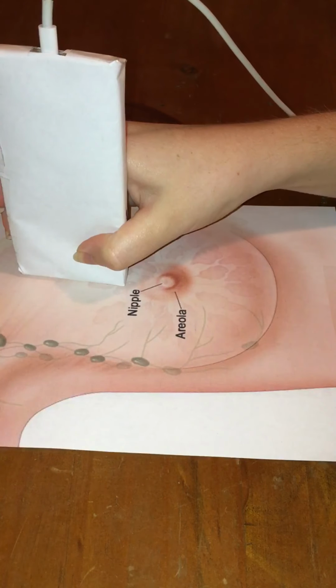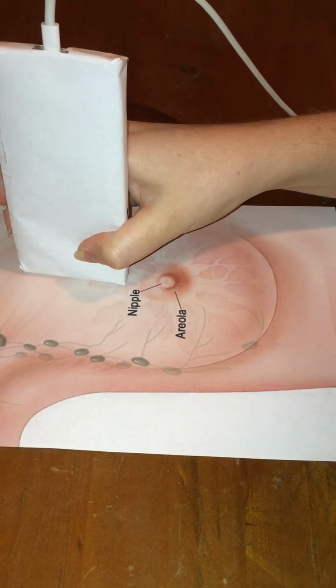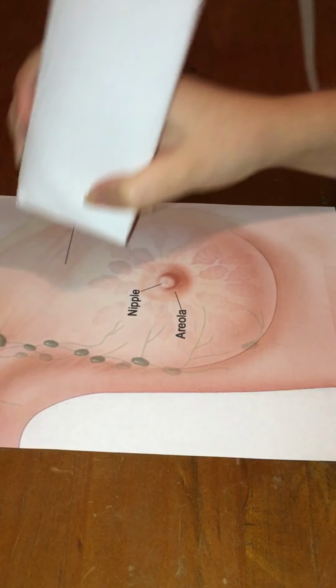In a clinical setting, I would perform two surveys of the inner and outer breast, as one would be for contour and the other would be for content.